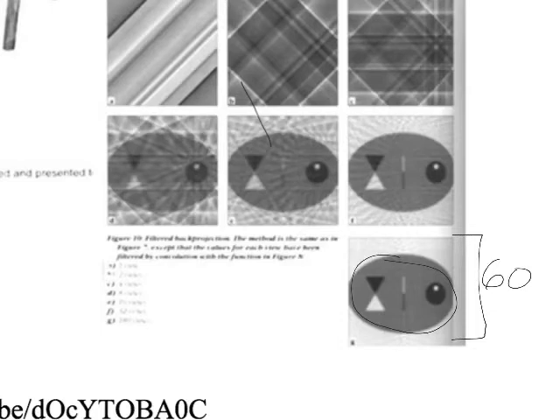Okay? So before, we called this stuff up here, what did we call this? The raw data, right? Now we're going to call this down here our image data. It is image data. So we took that raw data, we crunched all those numbers, and now we have something worth looking at, right?